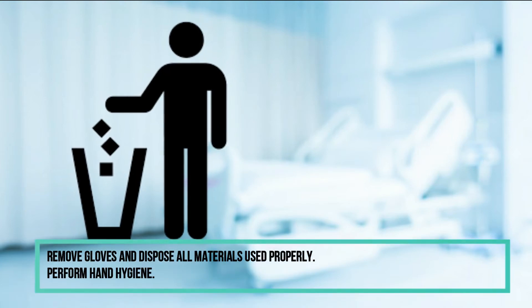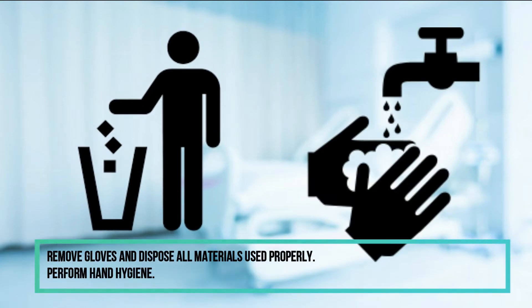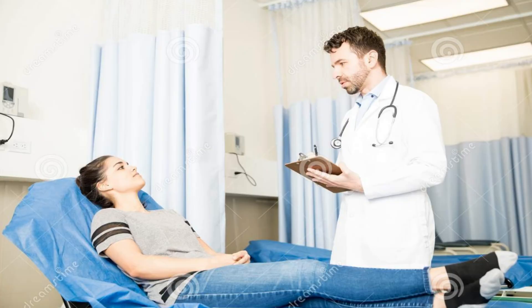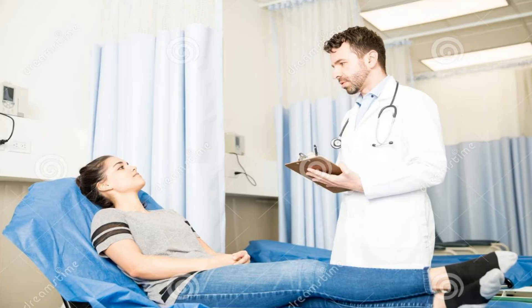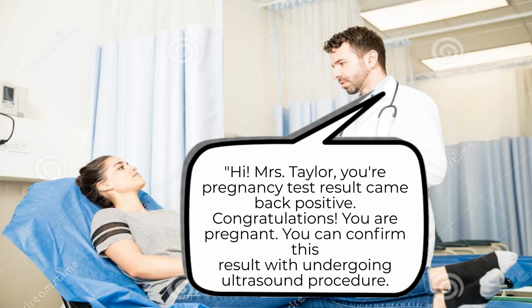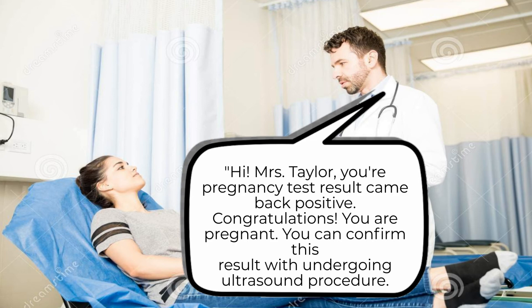Next, remove gloves and dispose of all materials used properly and perform proper hand hygiene. Lastly, results can be given directly to the patient. You can do this by saying: 'Hi Ms. Taylor, your pregnancy result came back positive. Congratulations, you are pregnant. You can confirm this result by undergoing an ultrasound procedure.'